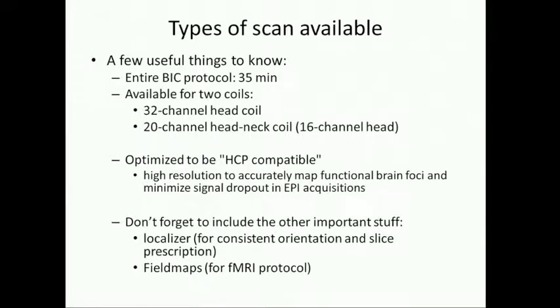So I mentioned the Human Connectome project, which is one of the biggest projects looking across different subjects and using a data sharing program. So our data are very, very similar to these. They're very high resolution and they give us really great functional brain mapping in the bold sequence that we have. So that's definitely a plus.